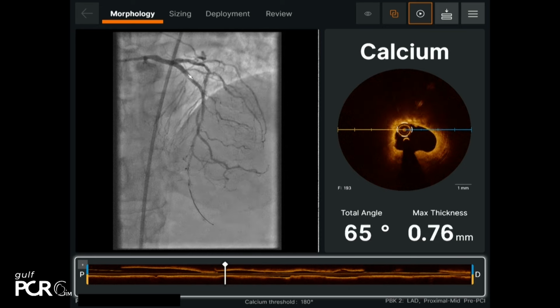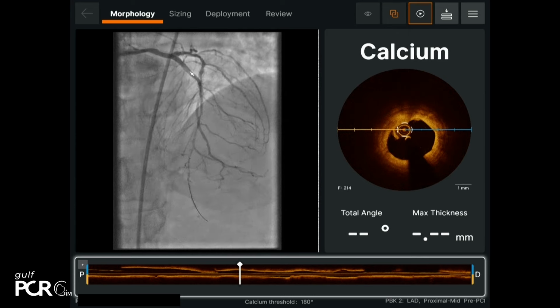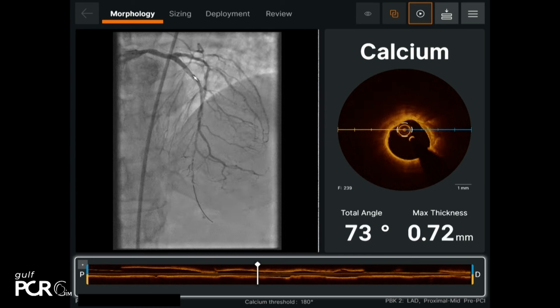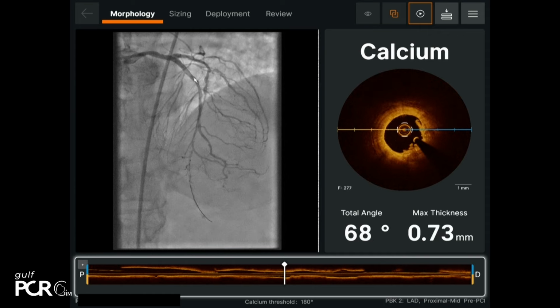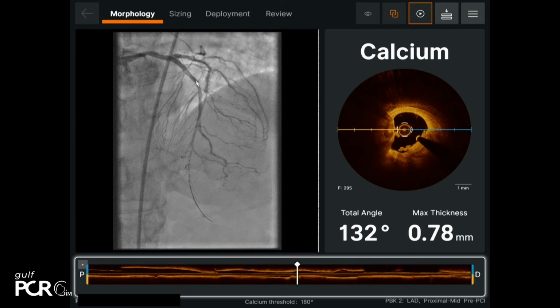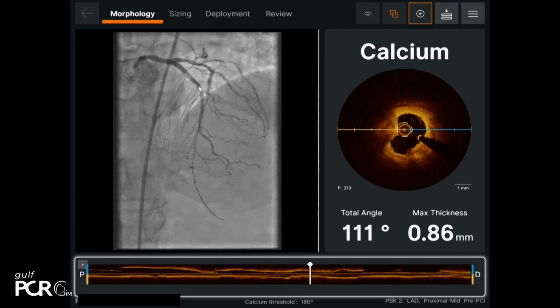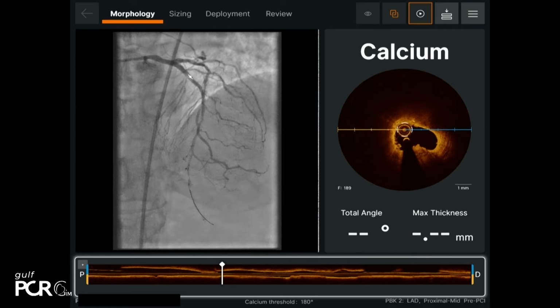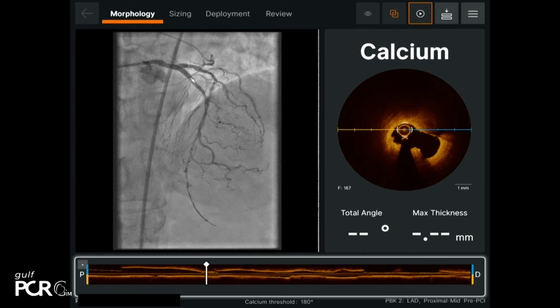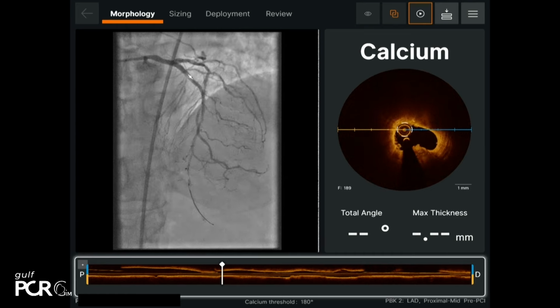There's some tissue there. There's some fracture at 8 o'clock, and some dissections there. To be frank with you, I don't yet see any fractured calcium, but you see some clots and dissections. Maybe here we have some fractured calcium at 8 o'clock. But at the nodule level, to me it looks smaller than when we started. I don't see really fractured calcium.